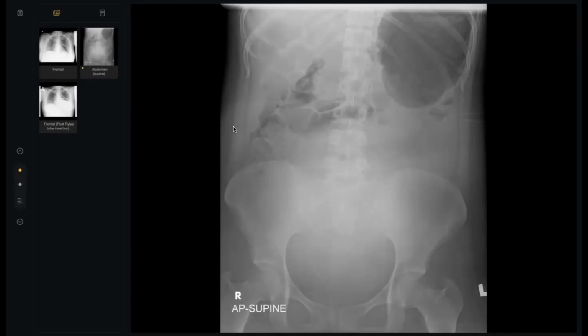This could be an evolving abscess or gastric torsion. How to differentiate? If it is a collection, I couldn't see a fluid level. If it is gastric torsion, this is supported clinically by the patient having retching and inability to pass an NG tube.